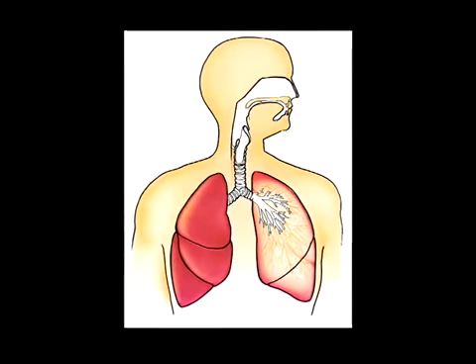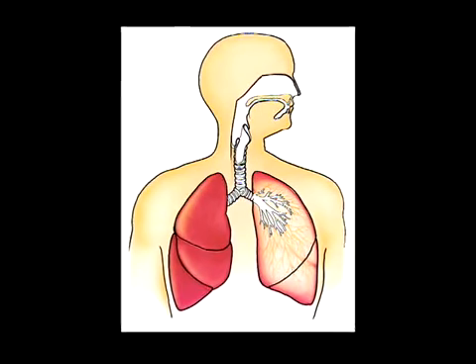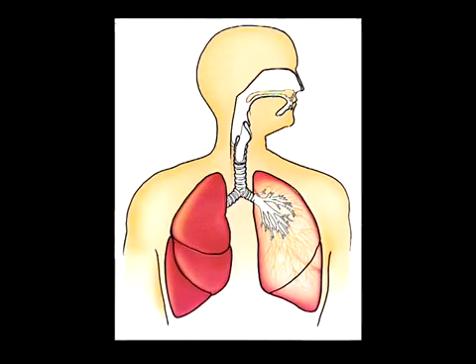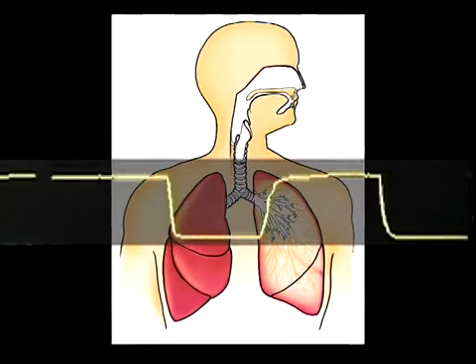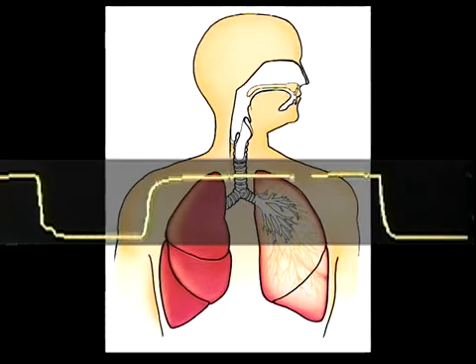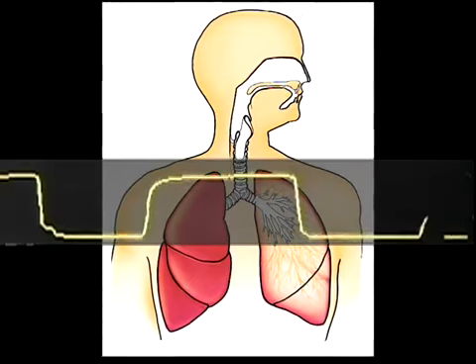Capnography is also used to monitor airway obstruction in patients with COPD or asthma. The end-tidal CO2 readings will give you an indication of how mild or severe their symptoms are and how well they respond to treatment. Normal end-tidal CO2 levels are dependent upon the ability of the patient's cardiovascular system to deliver carbon dioxide to the pulmonary circulation system. Any change in circulation will result in changes in the CO2 delivered to the lungs, and this will be shown as a change in the CO2 reading.